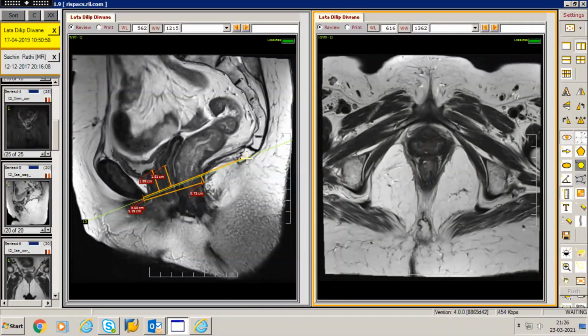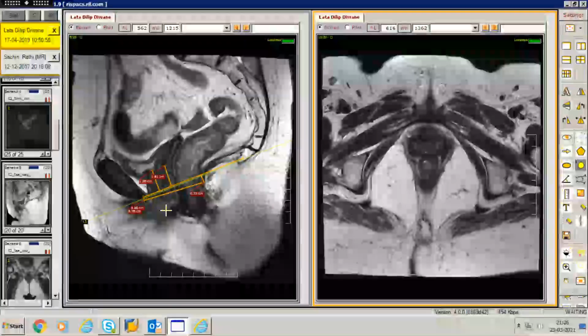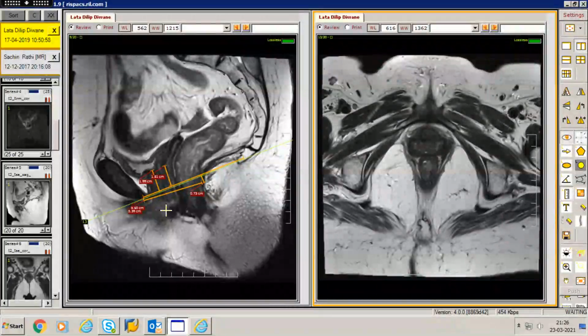So any structure which would descend inferior to the pubococcygeal line, which I'll come to when we understand exactly what the phases of defecation are and in which phase that would happen, then of course you would try to understand whether that movement is acceptable within the normal range, or is that a pathological descent which is happening in that particular patient.